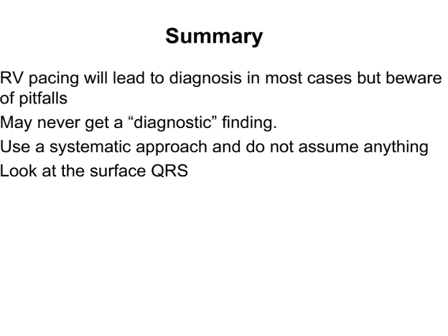All right, we did have a few questions coming in. First one here is from Dr. Akwawintalong. In your practice, how many atrioventricular extrastimuli do you give before calling it non-inducible SVT?